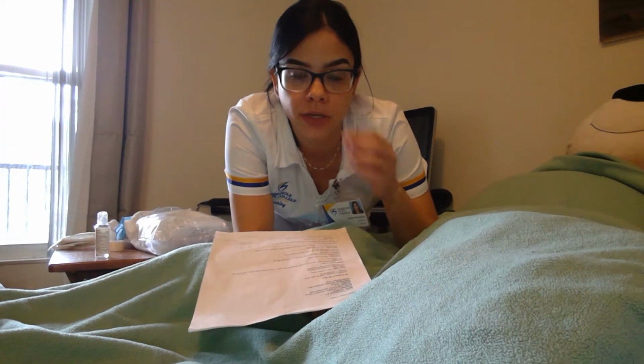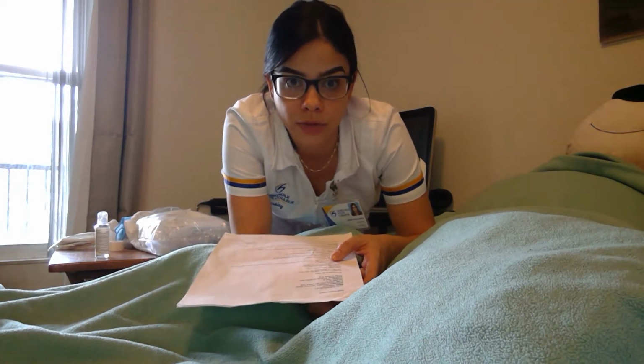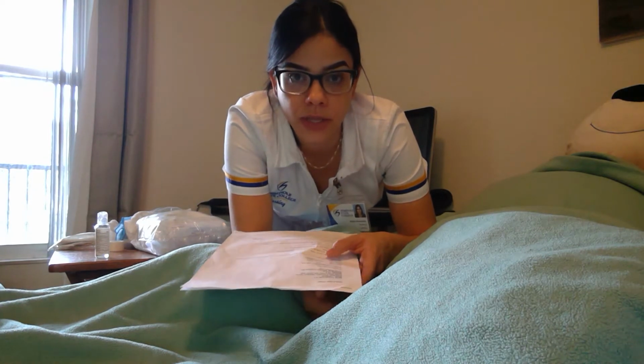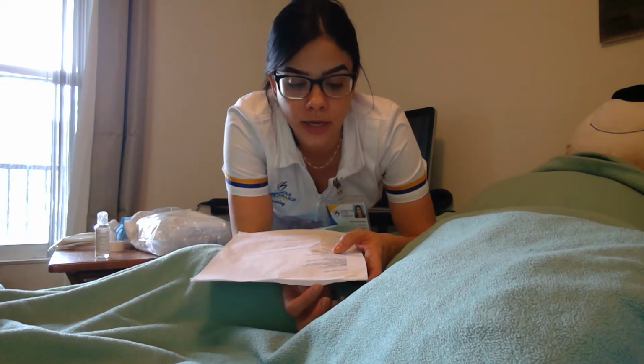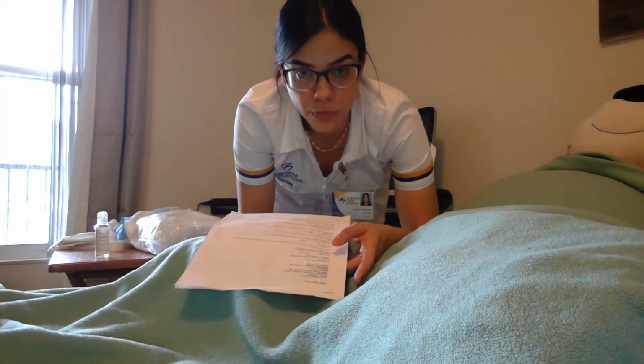Good afternoon, my name is Saida Gonzalez, and the purpose of this video is to demonstrate the insertion of a Foley catheter on a woman, female. Okay, so the first thing that I'm going to do is to check the patient's chart and make sure that she has an order for it.